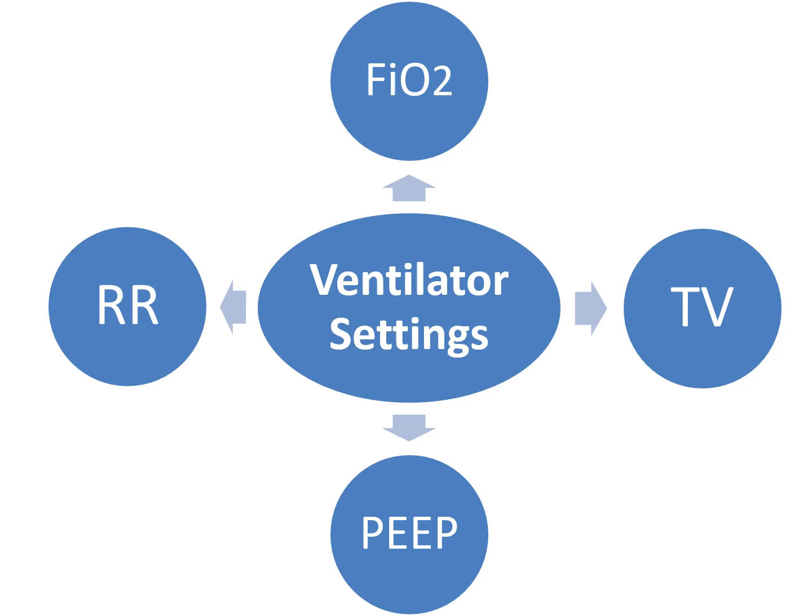You have to be very cautious with those patients, because those high PEEP settings can cause extreme barotrauma and can cause the patient to actually have a pneumothorax. So be very cautious with patients that do have PEEP. And PEEP can also cause hypotension because you are increasing your intrathoracic pressure as well.